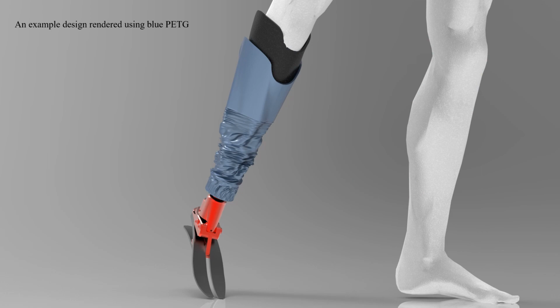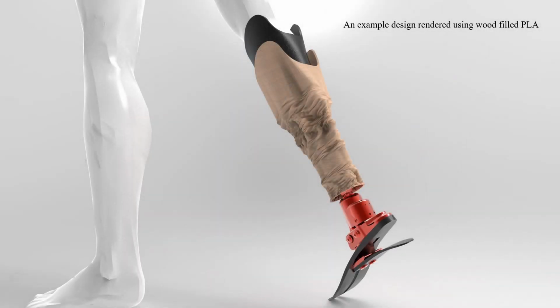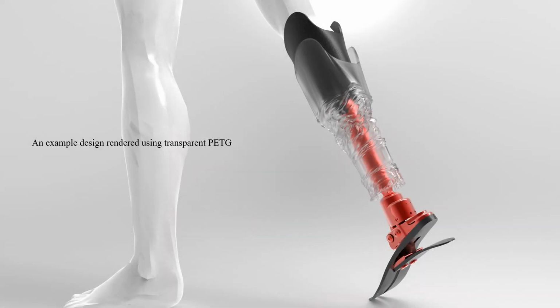Here is an example design rendered using blue PETG. And here is an example design rendered using wood-filled PLA. An example design rendered using black PLA. And this is an example design rendered using transparent PETG.